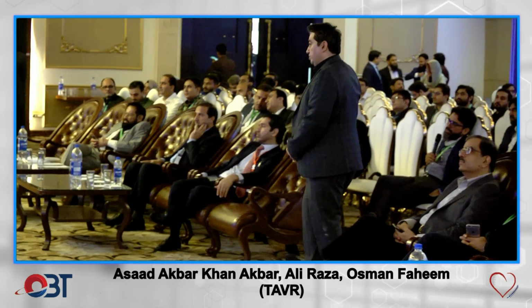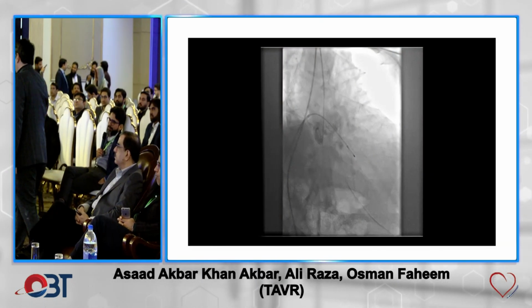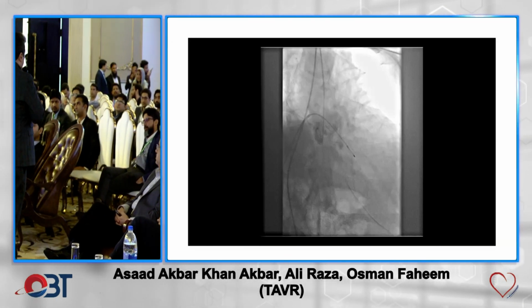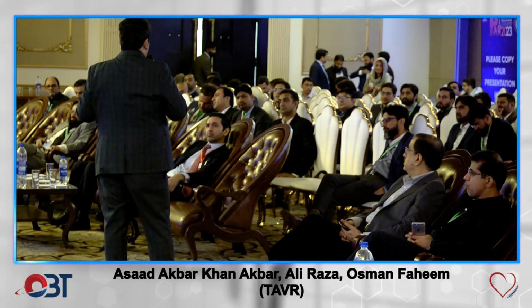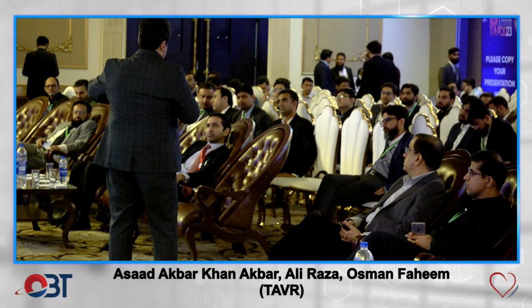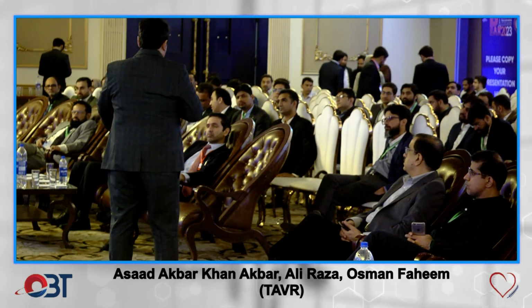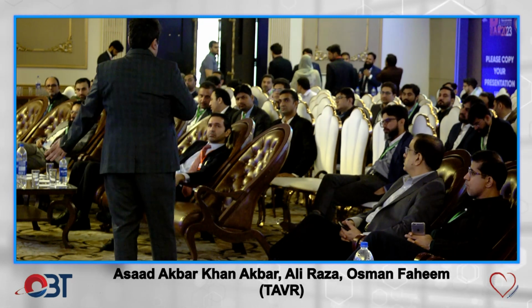So if a patient gets a heart block, then you get venous access. What I do is put a small wire in the other femoral vein, and it is just there. Through that, I complete the circuit as well. So I don't do the needle in the skin. I already put a small wire in the femoral vein, and if I need any access, I just put a sheath in and go through that.